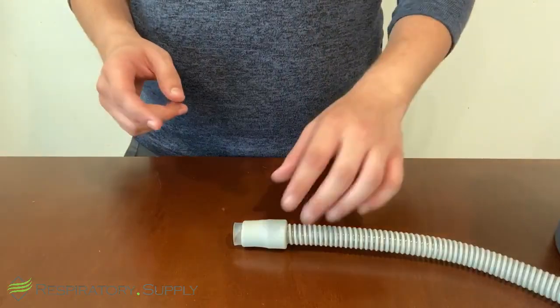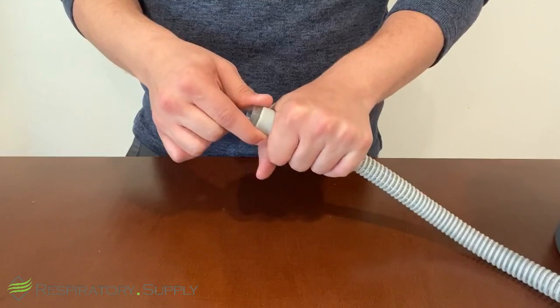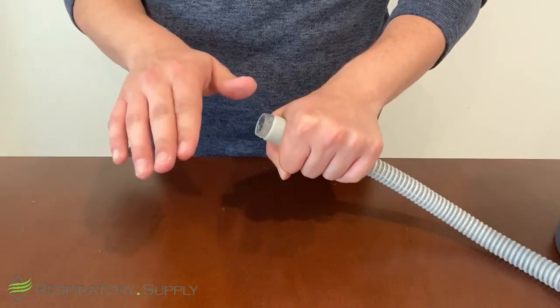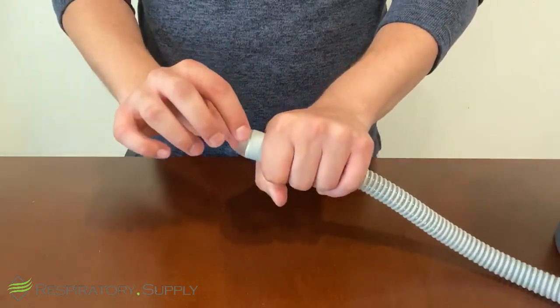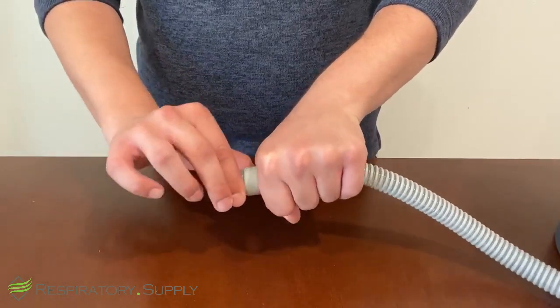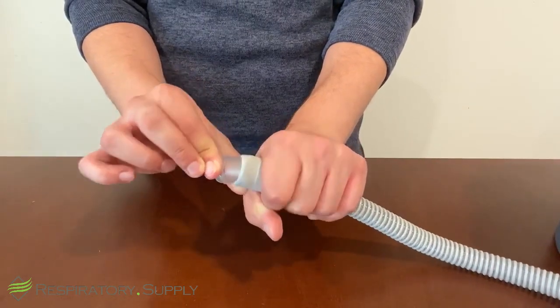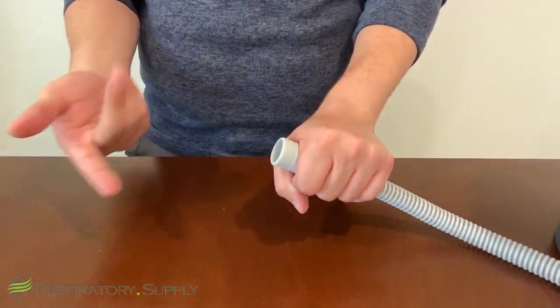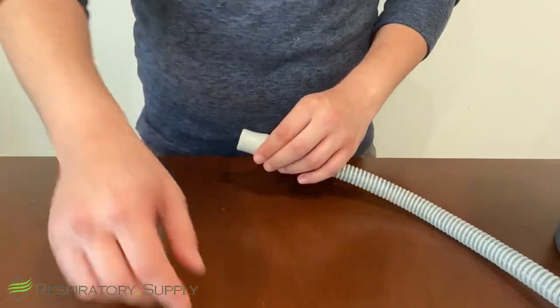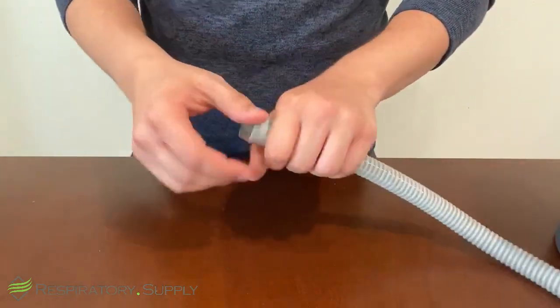To remove the Vitara connector, all you need to do is take your non-dominant hand, wrap it around the base of the rubber itself, but not too tightly. Then you'll take your dominant hand and you will grab the top of the connector with your thumb and index finger, and you will do an almost twig-like snapping motion. As you can see here, it pops right out, even a little bit too well. We'll do it one more time just so you can take a look. See, pop it back in there.